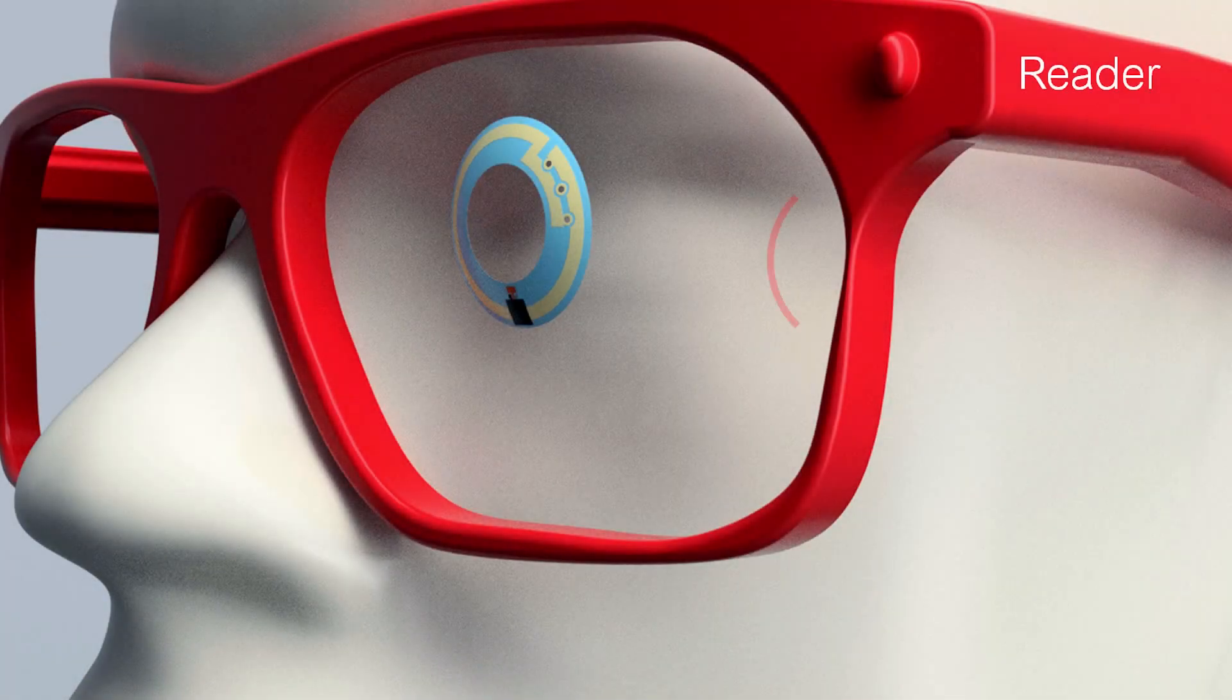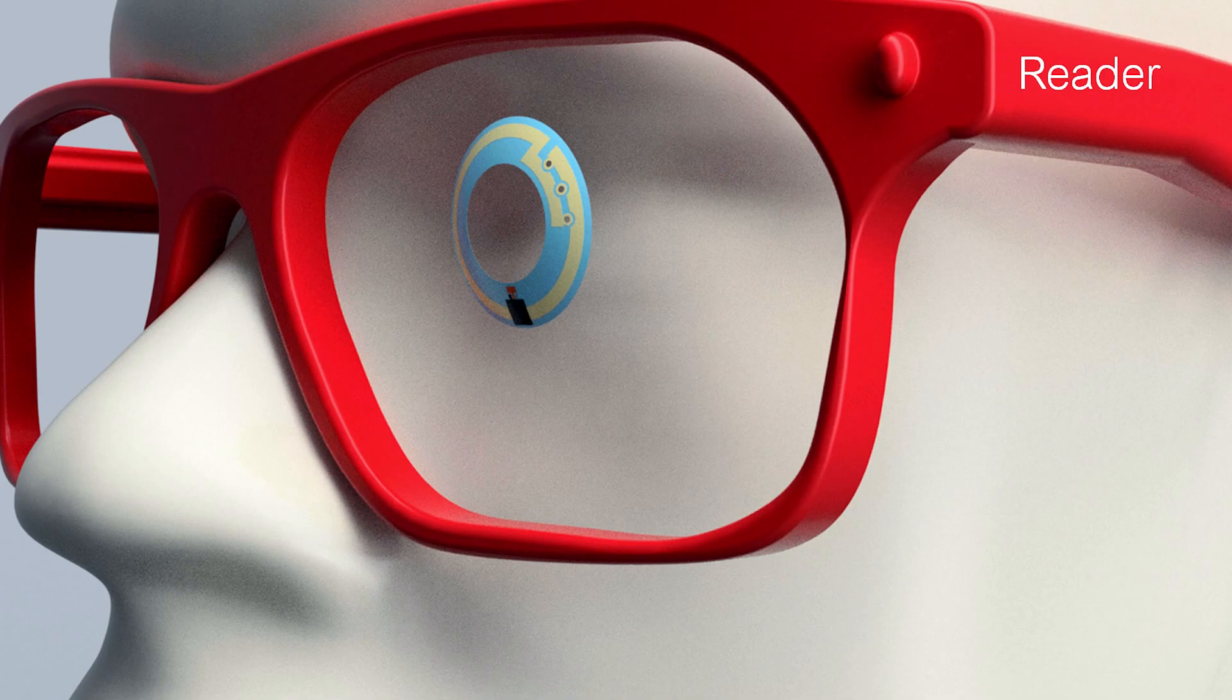For us, it starts with the reader device, which transfers energy wirelessly to the contact lens via technology called NFC, or near-field communication.